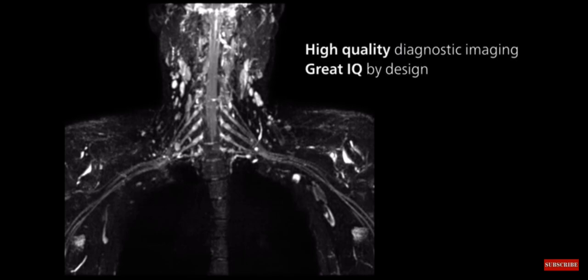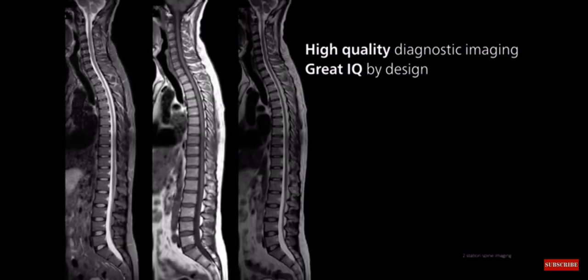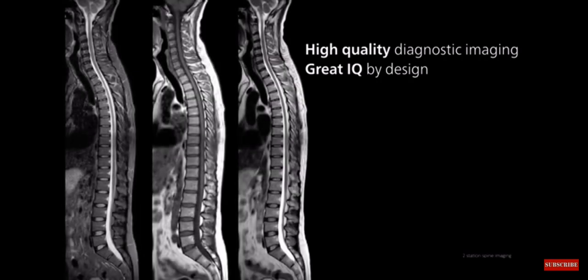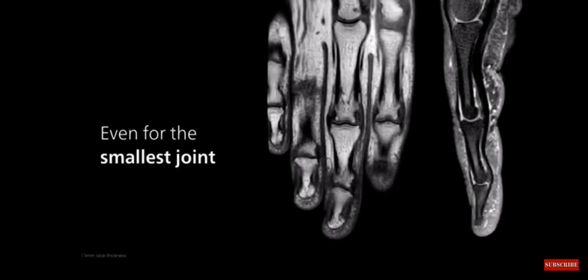You can count on high quality clinical images thanks to the new versatile breeze coils and robust scanning methods, even when imaging the most challenging anatomies and the smallest joints.